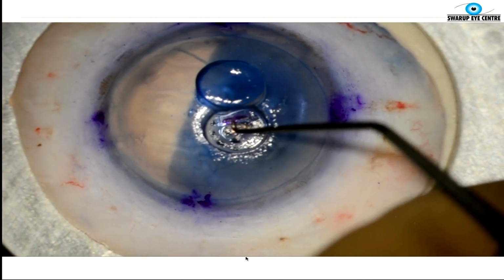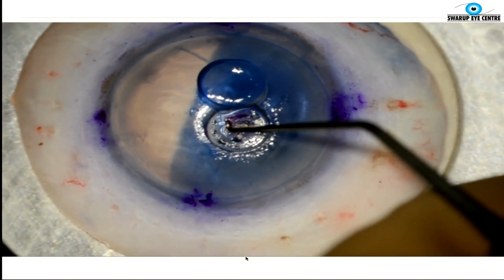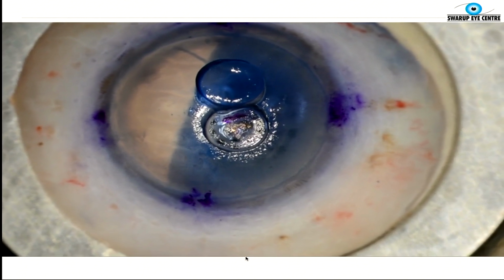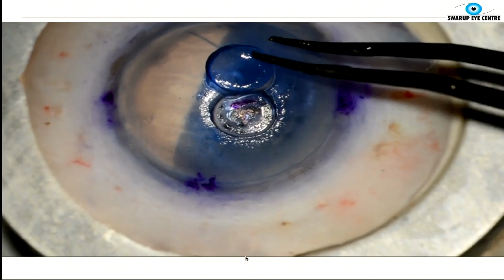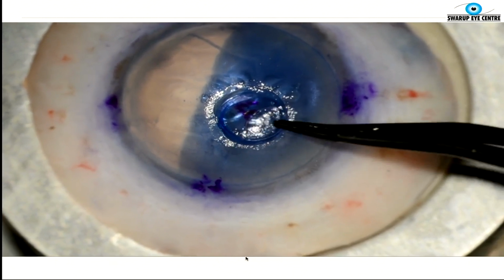So now the graft corneoscleral button has been inverted, and that punched button has been lifted up, and you can put any asymmetric mark. You have ready-made stamps, or you can just stain a Sinskey hook with gentian violet and put the mark. So it's important to put an asymmetric mark like F, S, or a P, so that you can check the orientation when it's inside the eye. Don't put an O.